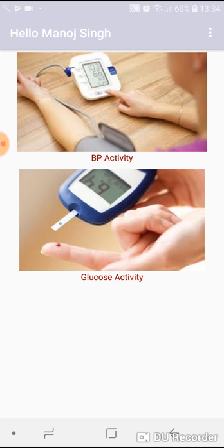Once you log in to the application you will see the screen like this. There are two activities: BP activity and Glucose activity. Glucose activity is used for monitoring your glucose while BP activity is for monitoring your blood pressure. First I will look into the glucose activity. I will tap the glucose activity icon.